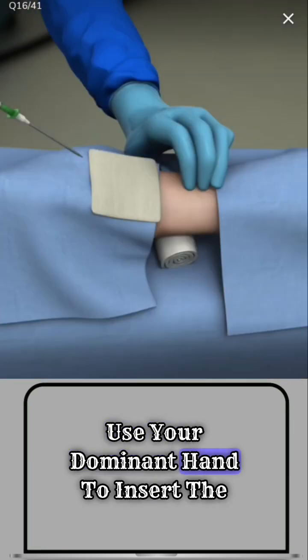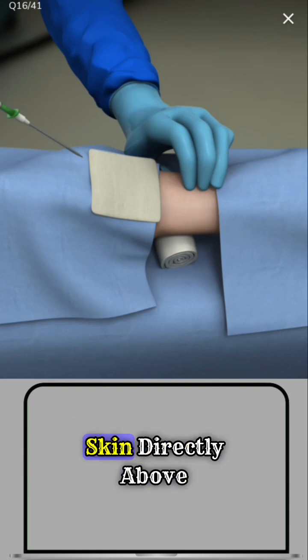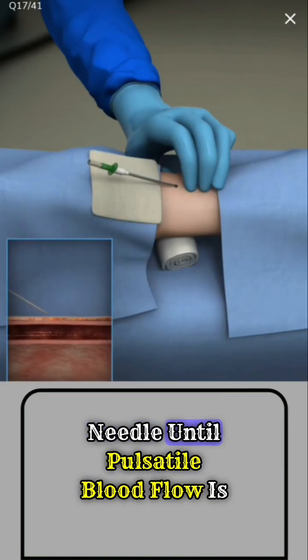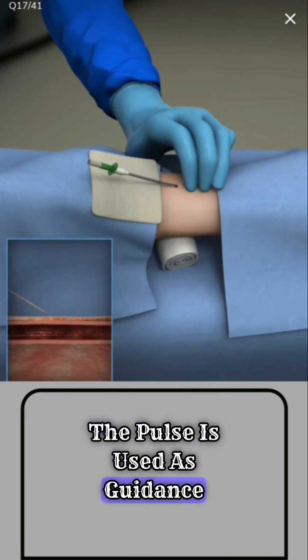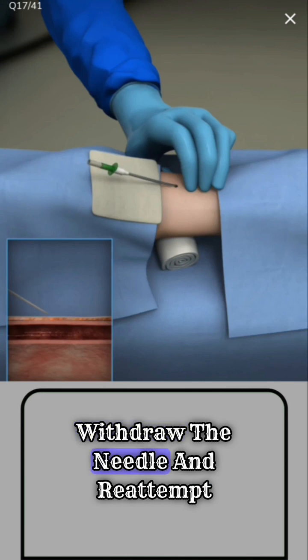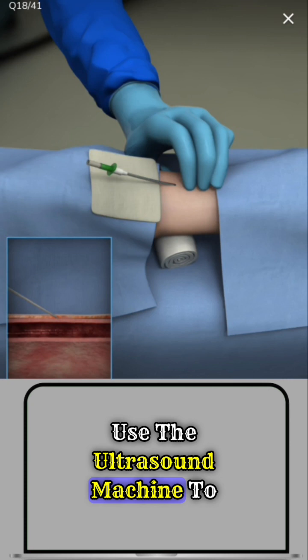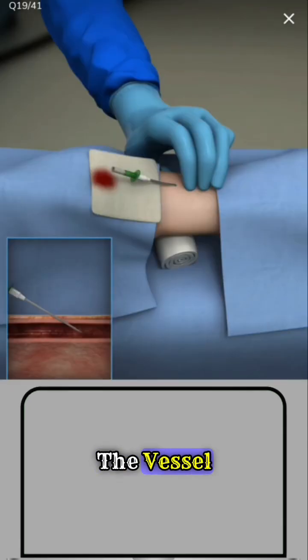Use your dominant hand to insert the needle at a 30 to 45 degree angle to the skin, directly above the pulse. Slowly advance the needle until pulsatile blood flow is observed. The pulse is used as guidance. If there is no blood return, withdraw the needle and reattempt using a different trajectory, or use the ultrasound machine to locate the artery. Continue to advance the needle through the vessel.